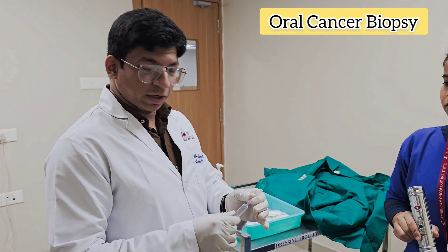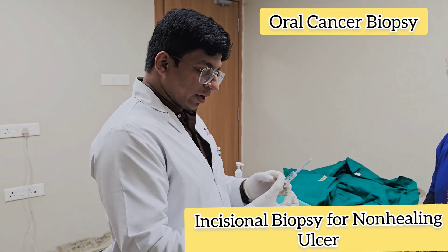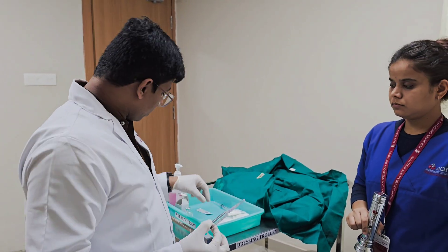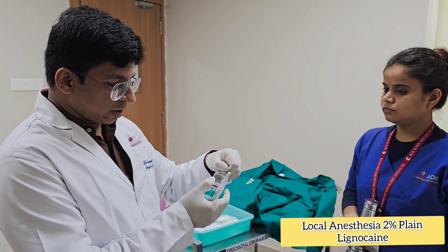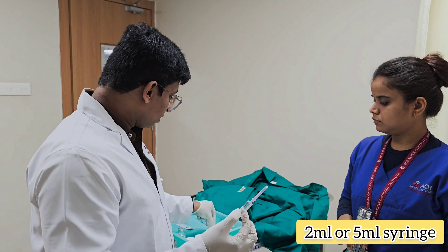Today we are going to demonstrate oral biopsy — incisional biopsy for any non-healing ulcer. First is local anesthesia, that's plain local anesthesia, lignocaine 2%, and we use a 5ml or 2ml syringe.